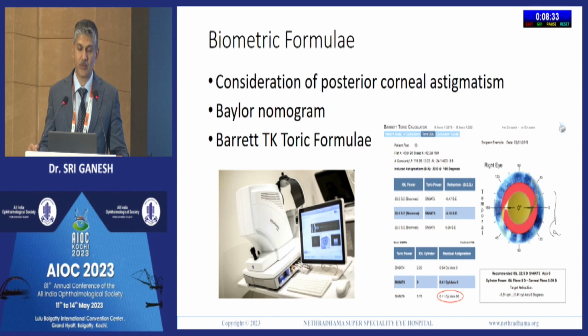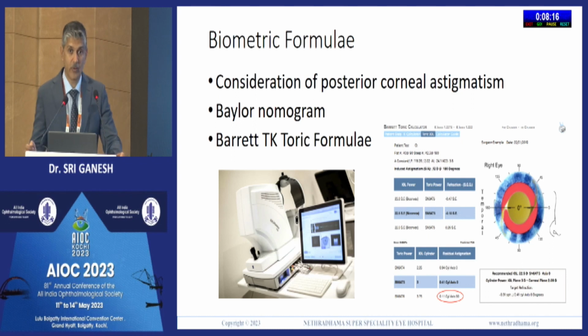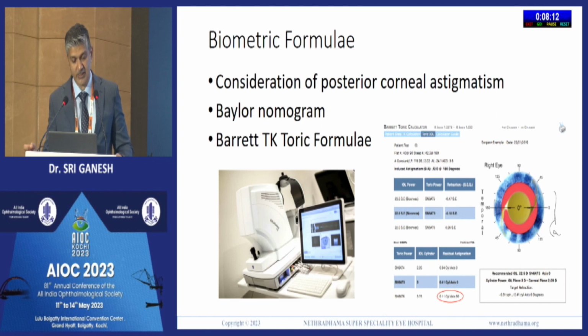And now you have most of the formulae taking into consideration the posterior corneal astigmatism, because this has a huge influence on the outcomes of the refraction. And most of the online calculators now available with different lenses incorporate the posterior corneal astigmatism.